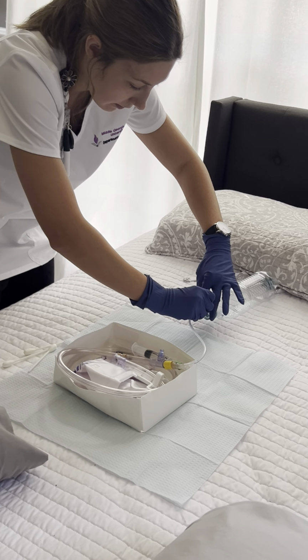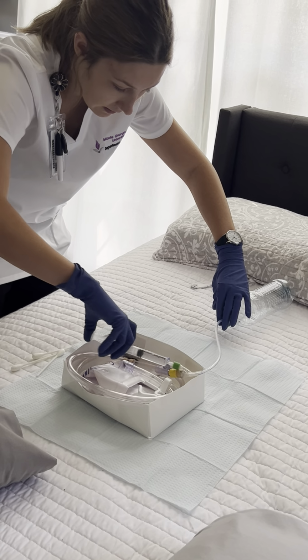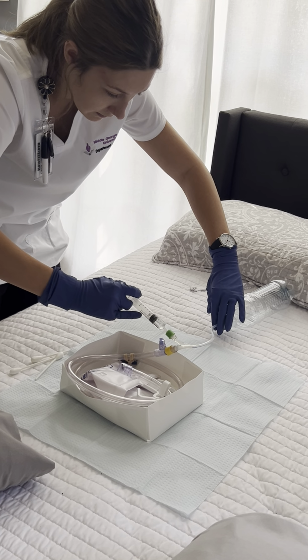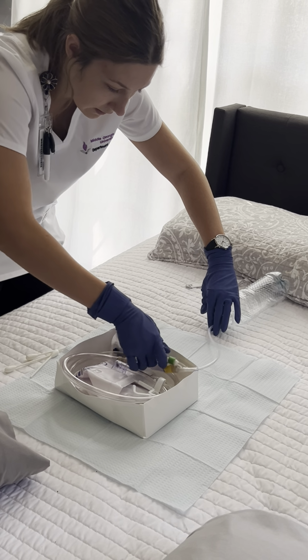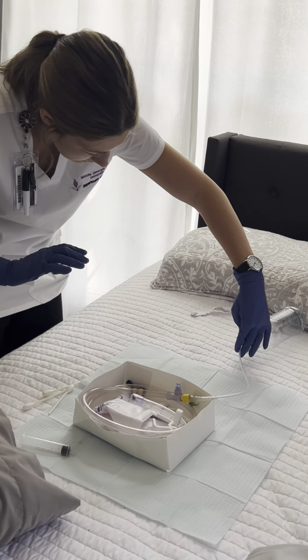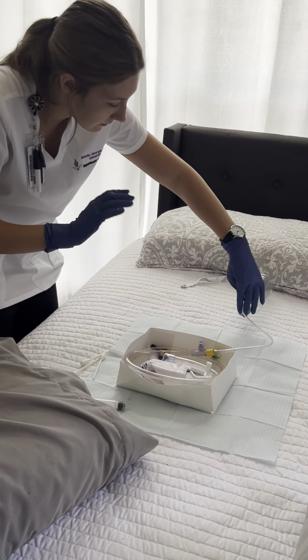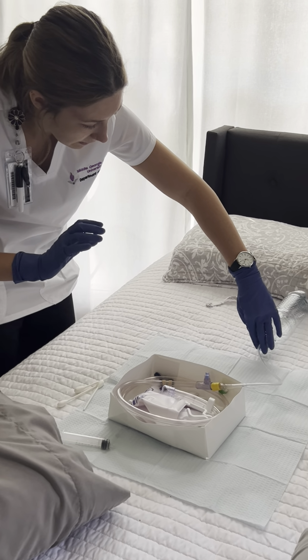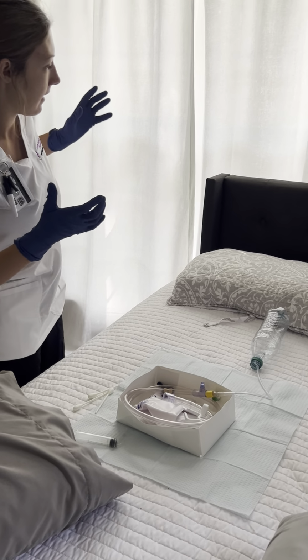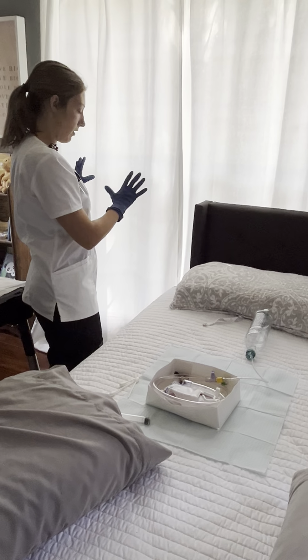2. Now I'm going to hold the catheter in place and insert my saline. Okay. Now I'm going to test it to make sure it's in place. And it is. So now I am going to let go. Dispose of my gloves. Get new gloves, non-sterile gloves.